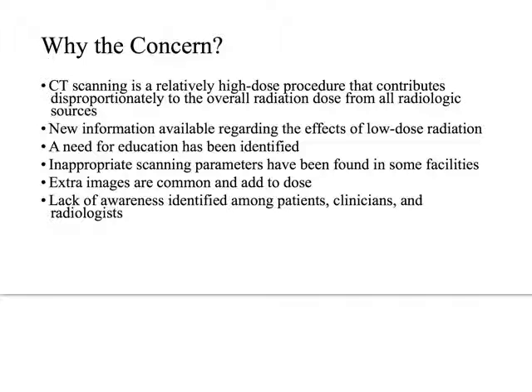There's been inappropriate scanning parameters found in some facilities, and we'll look at that here in just a minute. Extra images are really commonplace, and it's especially problematic in CT where they'll say, okay, just scan a little bit lower or scan a little bit higher. That's a problem. And then there's an overall lack of awareness.